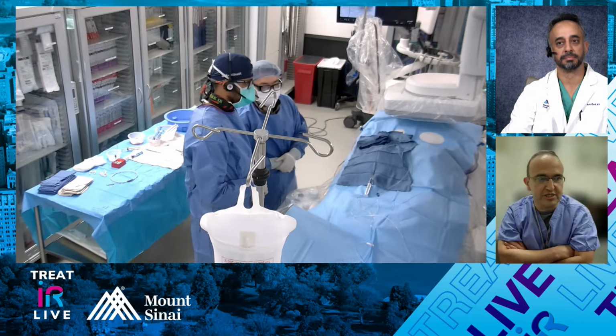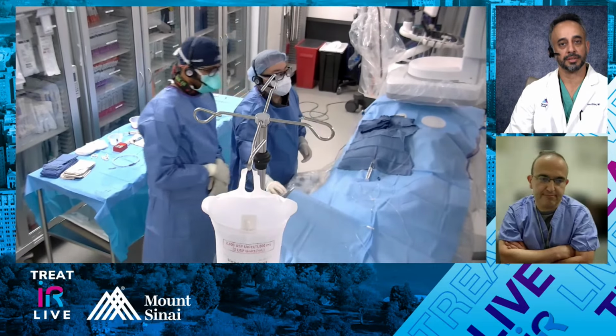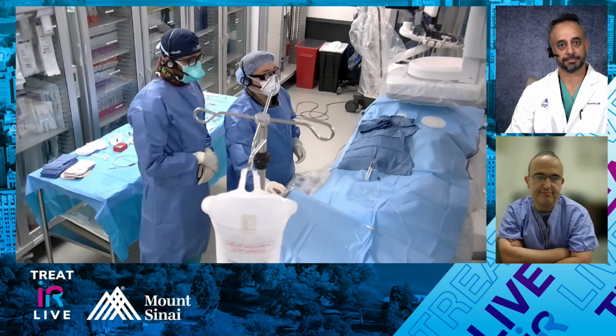Yeah, completely agree. Just to go through some images while you guys were waiting.